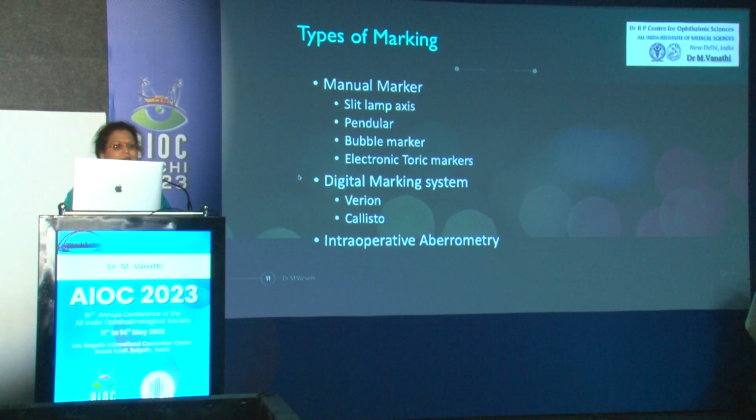I think you would have heard several courses here which talk about the type of manual marking systems, and there are several marking systems which you do have on your smartphones, which can help you, and they are more cost effective.